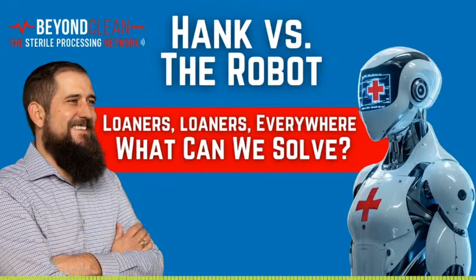Imagine having designated loaner experts on your team who are trained to, 1, understand common loaner systems. For high-volume partners like Stryker or Zimmer Biomet, techs could learn the key instruments, how they're used, and the quirks in reprocessing them. 2, master tray configurations. Knowing what should be in a tray versus what's actually there eliminates surprises and speeds up reconciliation processes. 3, identify bioburden hotspots.